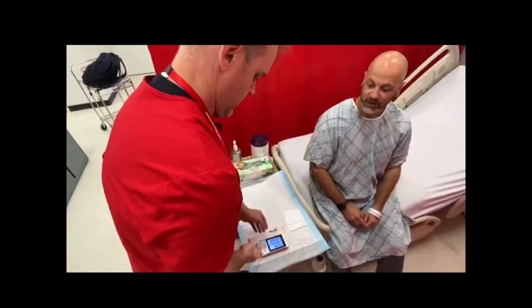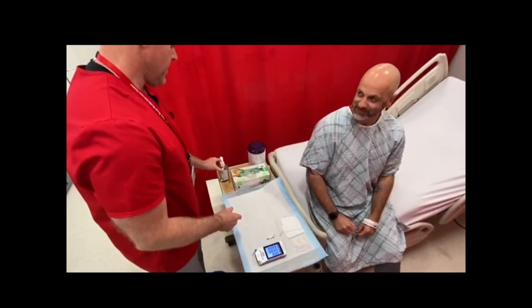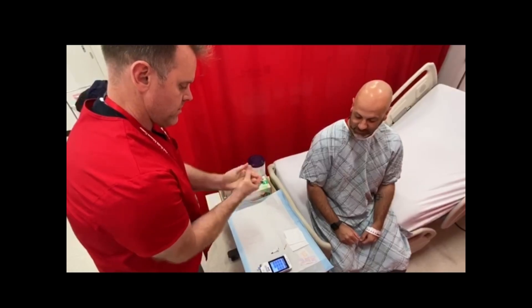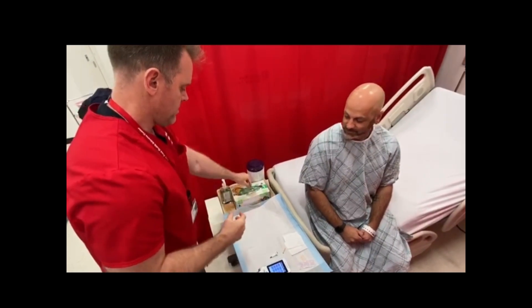Explain the procedure to the patient. Perform hand hygiene. Don clean gloves.